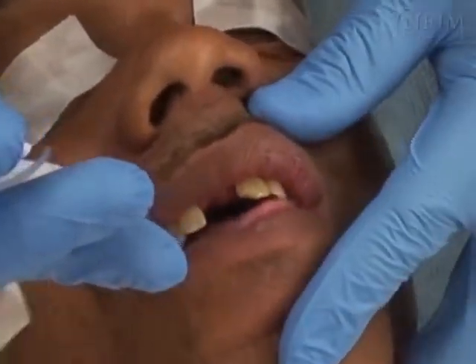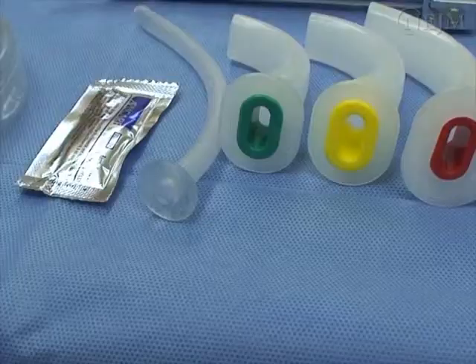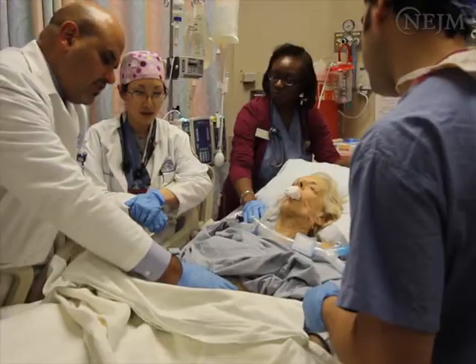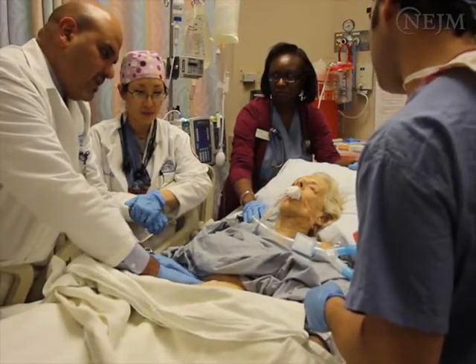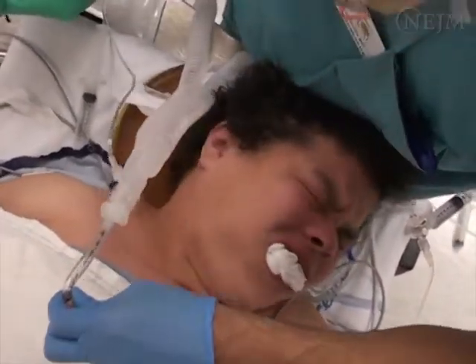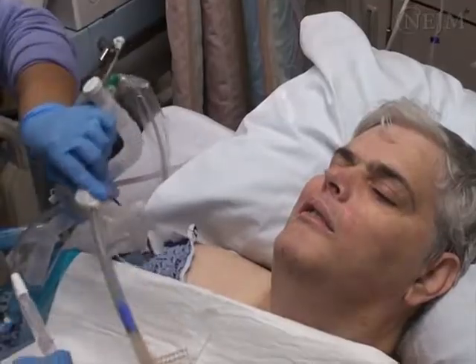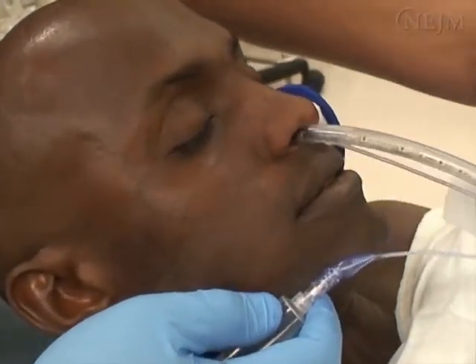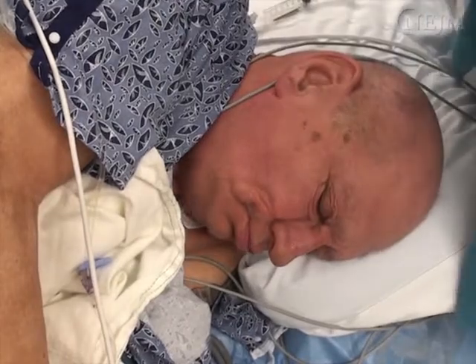Endotracheal extubation should be performed without causing trauma, while maintaining adequate oxygenation and ventilation. Appropriate equipment for suction, ventilation, and re-intubation should be available. If extubation is judged to be unsafe, the procedure should be postponed and the patient should be re-evaluated. Most complications related to extubation are preventable. Before performing extubation, the clinician must carefully prepare the medical resources needed to address foreseeable complications. A failed extubation can lead to a precipitous deterioration in the patient's condition, and attempts to improvise solutions under these challenging circumstances are rarely satisfactory.